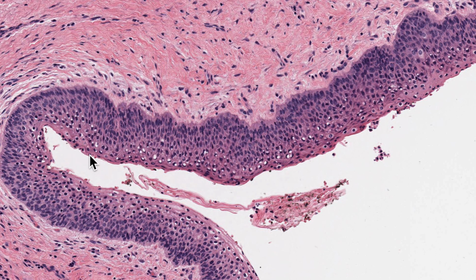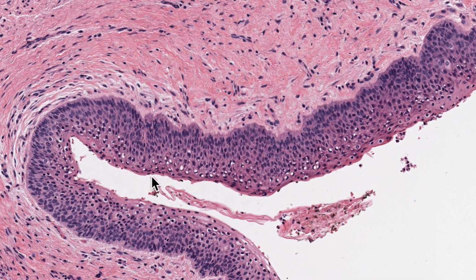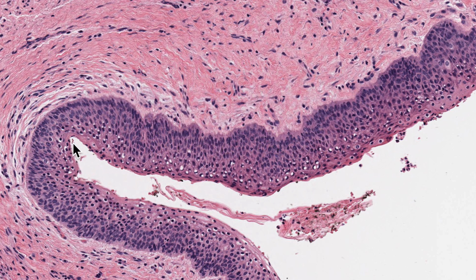And we have the surface of the epithelial lining which is not smooth, instead it is thrown into folds. If you keenly observe, the surface of the epithelial lining is definitely parakeratinized. The reason I'm saying parakeratinized is because I see the pyknotic nuclear remnants on the surface here, and the surface is never smooth, and you see these multiple folds. It is thrown into multiple folds, and this is called corrugation. So the surface is parakeratotic and definitely not smooth, and that is called a corrugated surface.